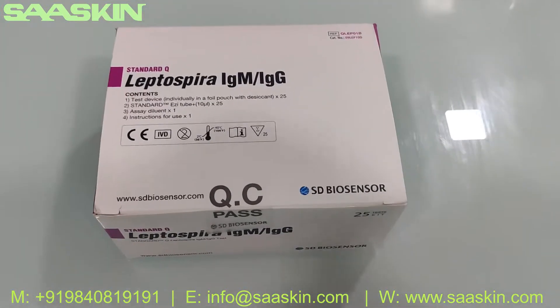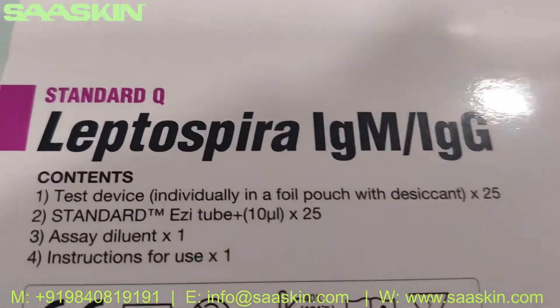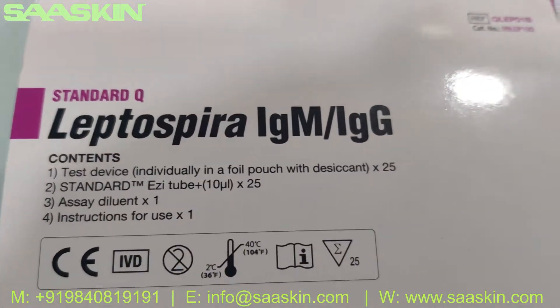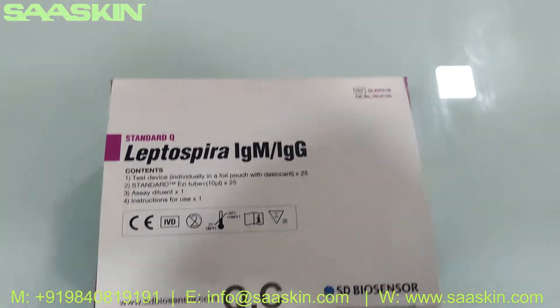Hello everybody, today we are going to see the unboxing of SD Biosensor Standard Q Leptospira IgM and IgG antibody rapid test kit. This is the IVD certified product — this is how the box looks like.